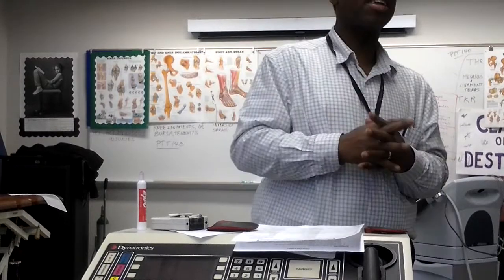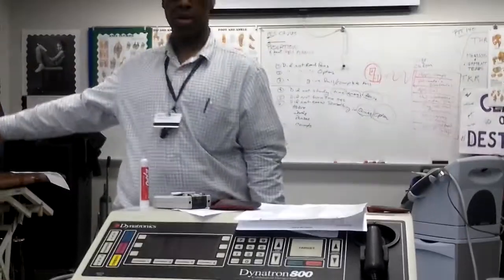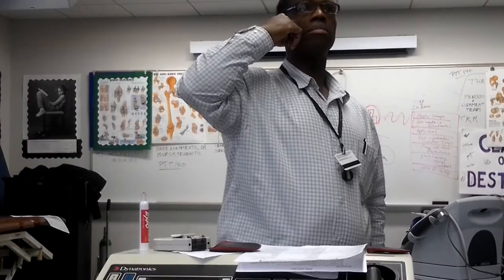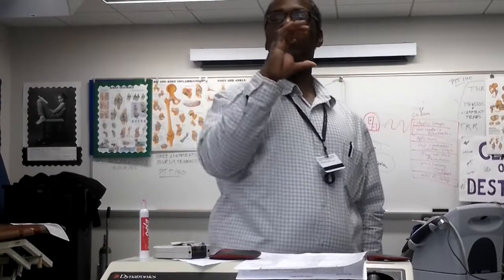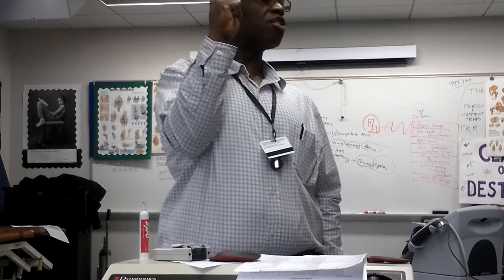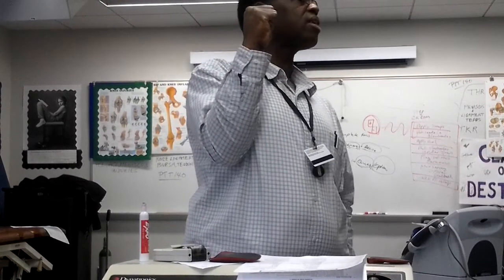Sensory. Where does sensory fall on the strength duration curve? Earlier, the first curve. Now, in the next book, we're going to get into sub-sensory. When we turn up the intensity, we're not going to touch that first line, so for the most part they won't be able to tell us they have tingling.